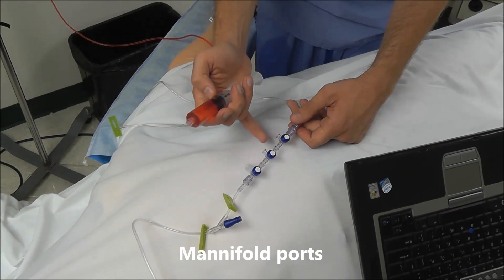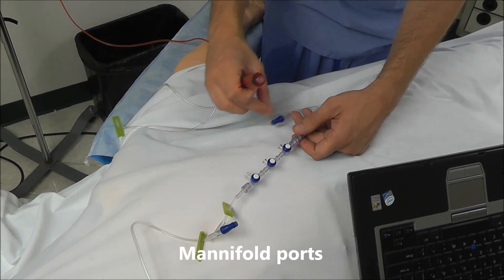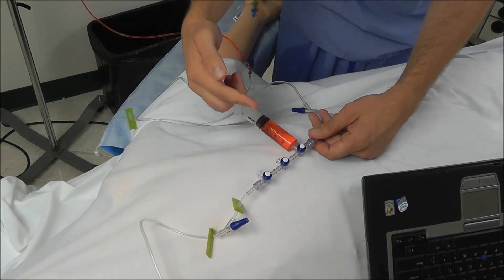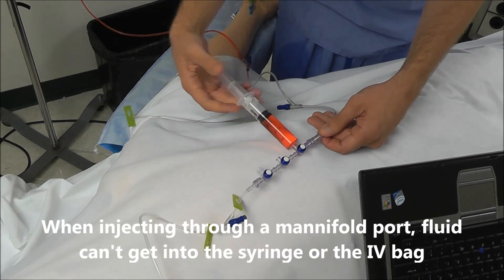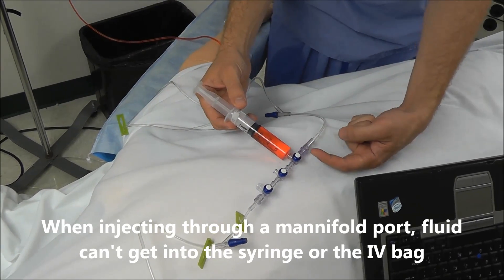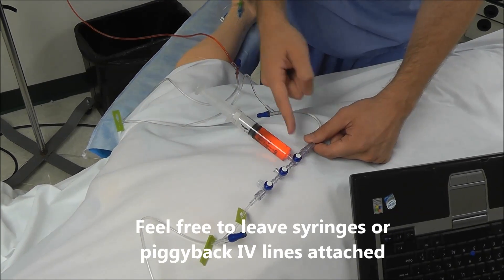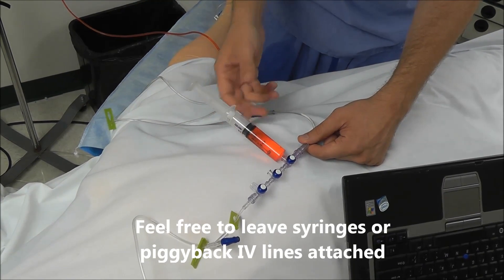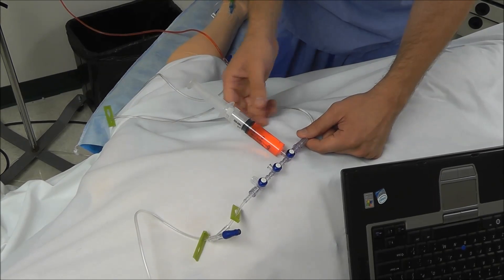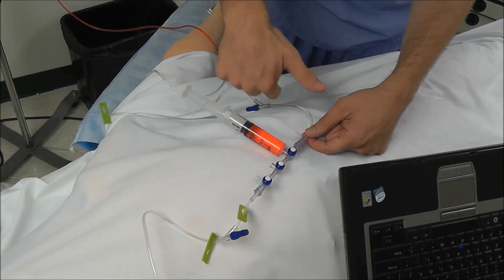Manifold ports are different from luer lock ports. A manifold port has one-way valves built in that prevent fluid from backing up toward the main line and also prevent fluid from backing up into your syringe. With a manifold port, you can leave a syringe attached or a piggyback drip connected with no chance of fluid backing up into the piggyback line or toward the main line.